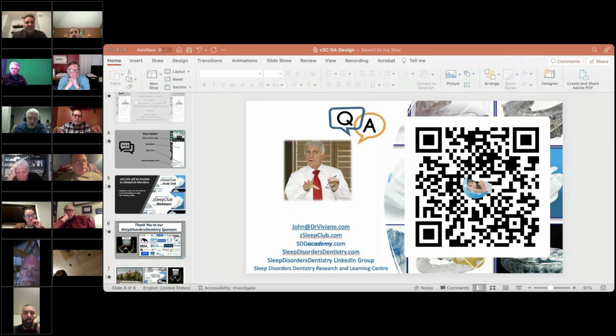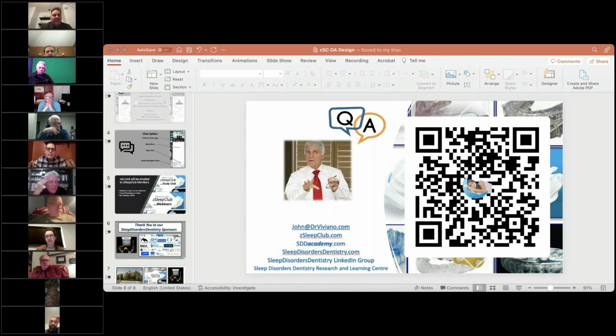Why do we need to go to the model? Is there a benefit to that? The only reason to go to the models, John, was when it's a full replacement of all the material. Oh, right. So if you're just enhancing retention, adding a few beads right into the appliance, go in the mouth, and you're good. Okay, I get it. Exactly. Sorry if that wasn't clear. Thank you, John.